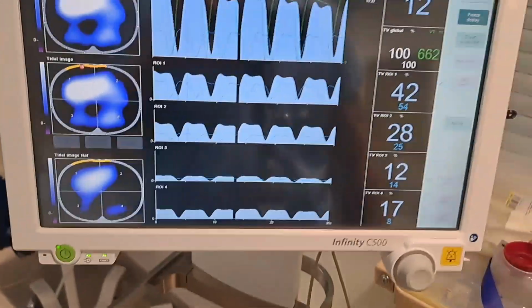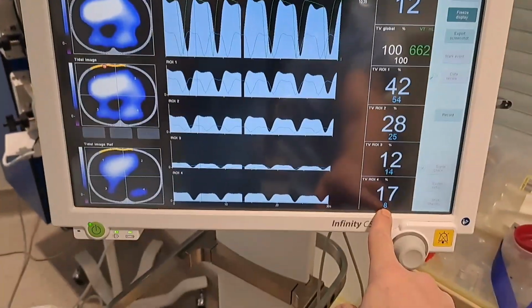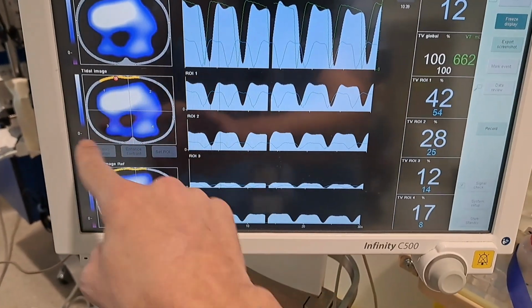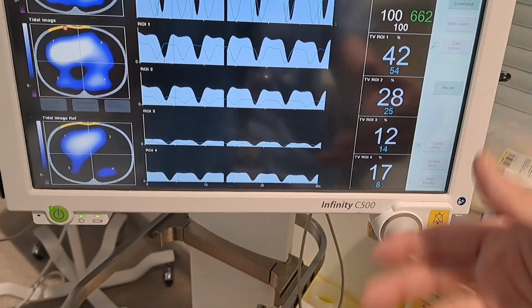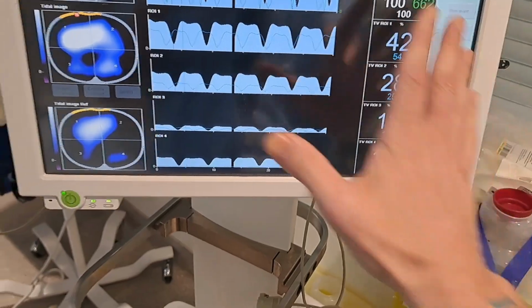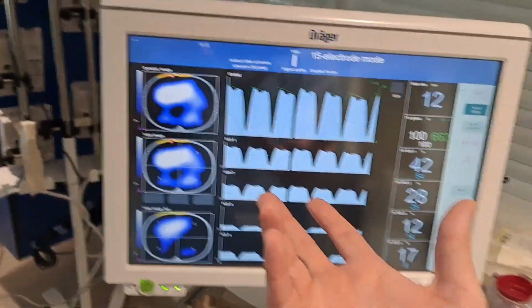What else can I say? I mean, things are going really well. Like, we only had 8% in this small area, and then we're getting to 17%. And what we really want is ideally to have 25% in all quadrants. It's a big difference. We're starting to win back. This is 60, 70, still a lot more on that side. But so this is the deal, guys.